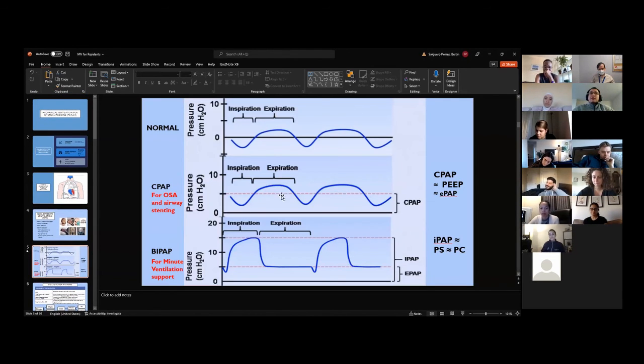Yes. So are you seeing the graph here? Yeah. So this is the difference, right? Because it's just providing you the PEEP, positive end expiratory pressure. Obviously, the inspiratory pressure is higher, but when you subtract the expiration from the inspiration, the delta remains the same. Therefore, because the delta between end inspiration and end expiration didn't change, the amount of tidal volume you're producing doesn't change. The only thing that is changing is how much PEEP you're having and how much alveolar recruitment you can get from that. But the effective tidal volume the patient is doing is the same. Okay, I see. That makes sense.